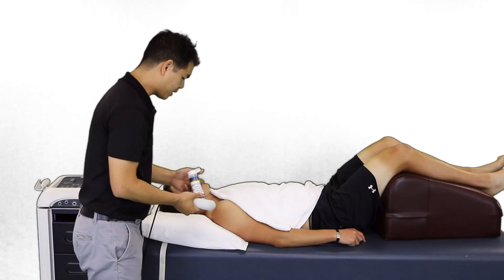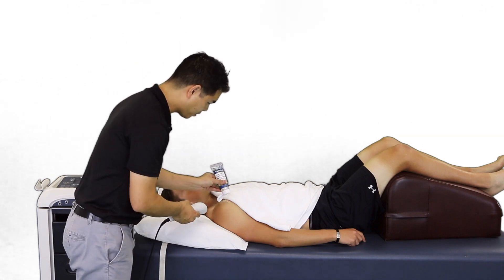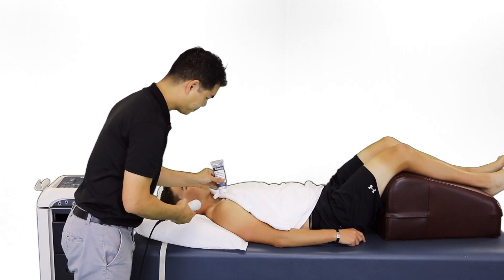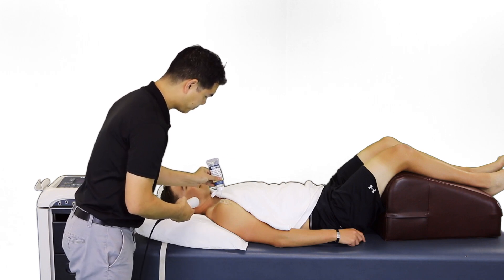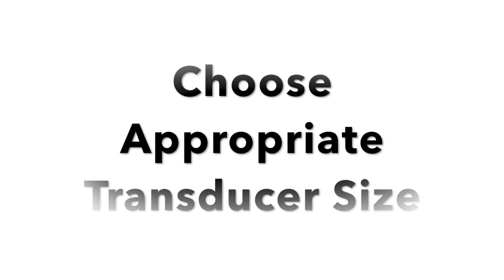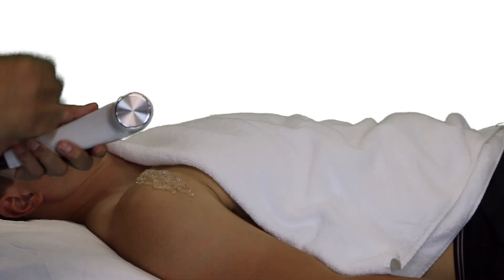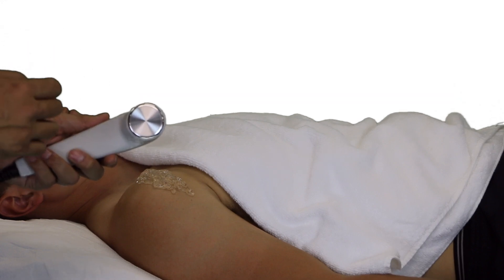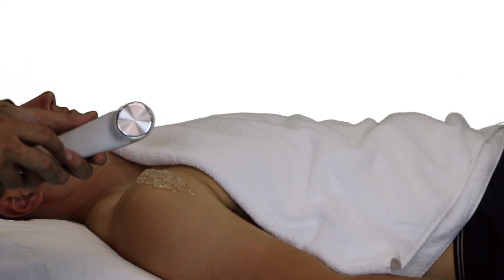I'm going to apply a liberal amount of gel here. Always select an ultrasound head size that has an effective radiating area of half the size of the treatment area.